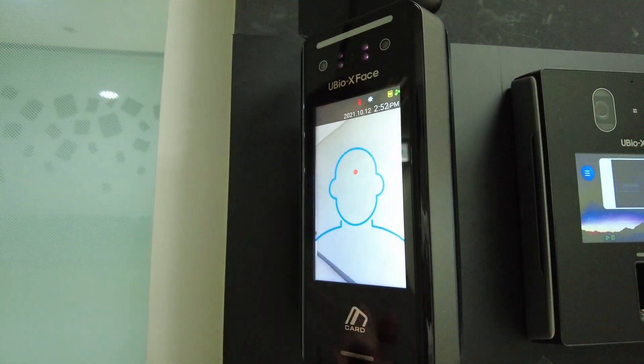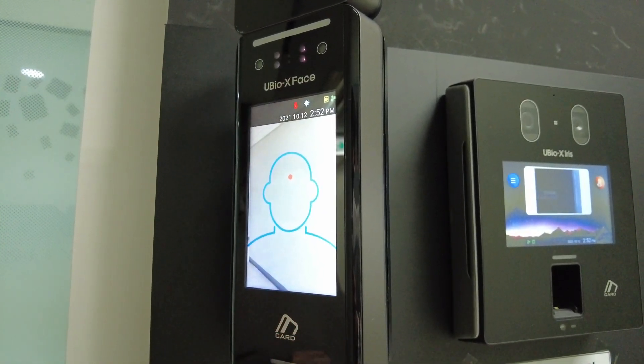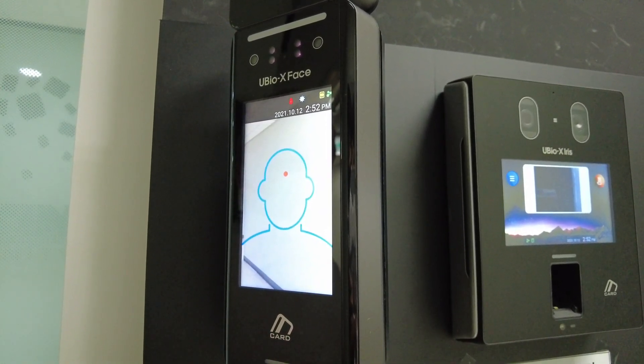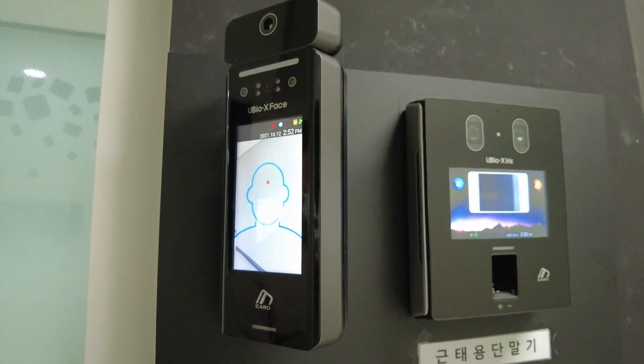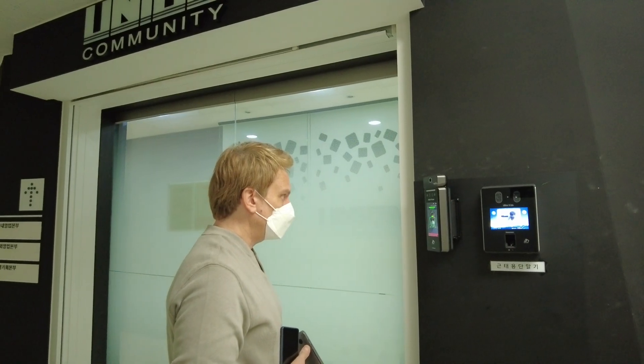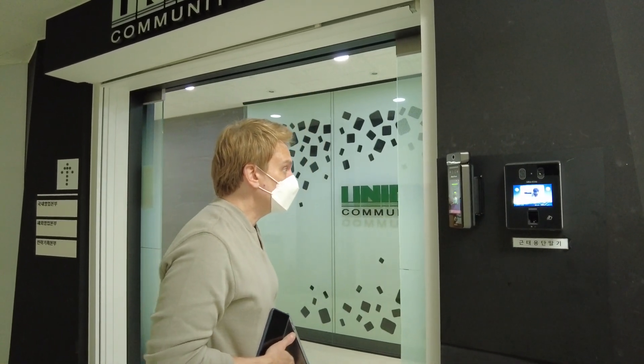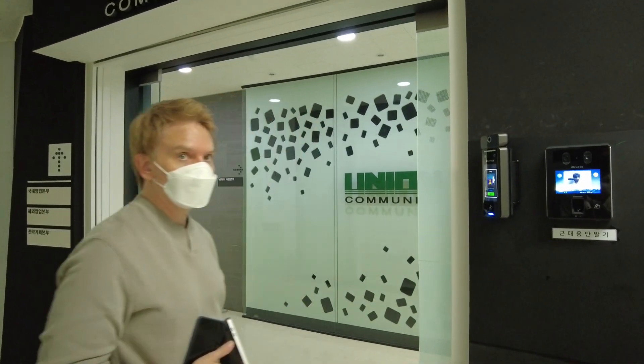So it's not a walk-through application. It's requiring the user to go up and put their face to the device itself and take the temperature very accurately. So if I walk up to the device and put my face, it's going to do it precisely for a period of time — it's not just a simple walkthrough.